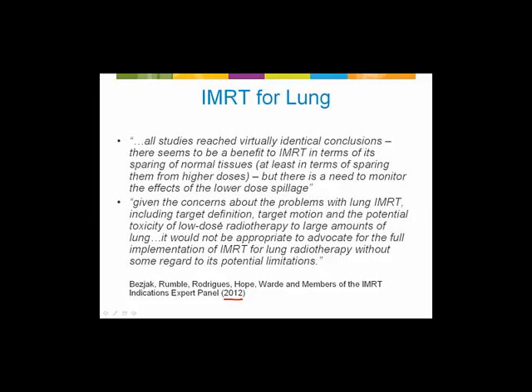Okay, back to what I'm going to focus on here mainly, which is target motion. Again, not gating and motion control, but when we treat ungated, what sort of things do we need to be aware of in our planning process to make sure that we can deliver dose accurately? And secondly, I'm going to talk about the effect of low-dose radiotherapy to large amounts of lung. Okay, start with the lung toxicity issues.